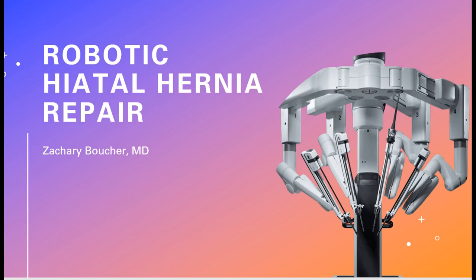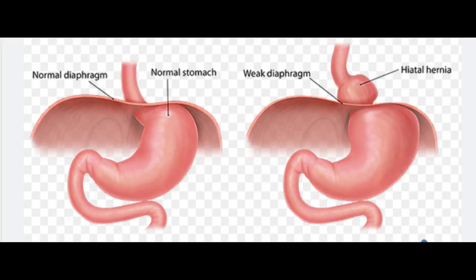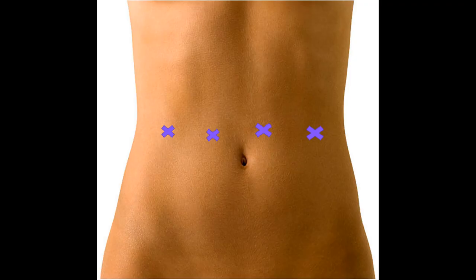This is a robotic hiatal hernia repair. A hiatal hernia is when the stomach gets pulled up into the chest. As demonstrated here, part of the stomach is pulled up into the chest through a widening of the esophageal hiatus, or where the esophagus comes through the diaphragm muscle.